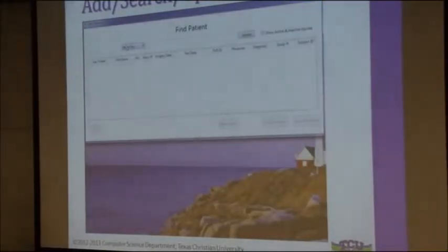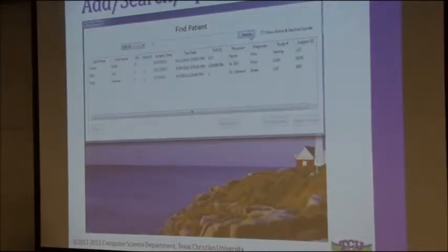And so we notice that we selected the left leg, and we actually want to test the right leg. So we're going to go in here to search patient. And we're going to search by his Texas Health Resources ID number, which is 1. And this brings up all the patients where their THR ID starts with 1. And we're going to select our patient here, Horned Frog. We're going to go to update patient.